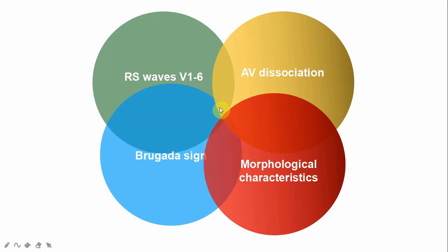I use Brugada criteria all the time whenever I find a wide complex tachycardia. It saved so many lives. It needs to be remembered that the Brugada criteria is not 100% correct in the diagnosis of VT. However, among all the different criteria available, the Brugada criteria may be one of the best.